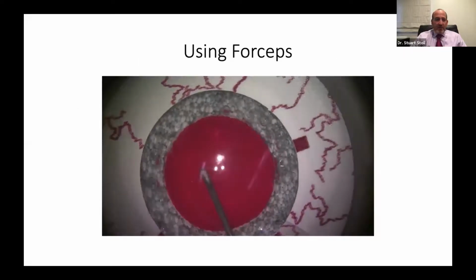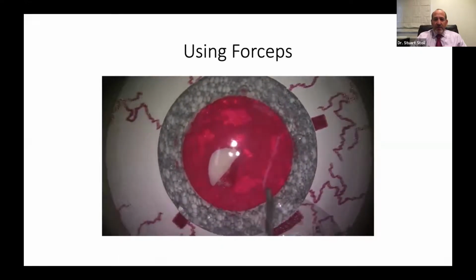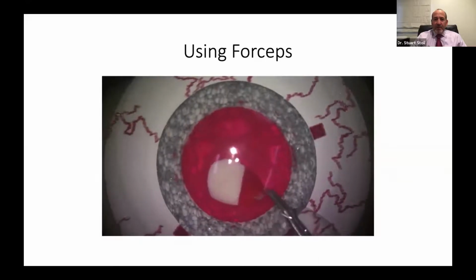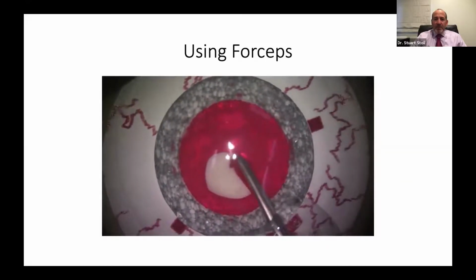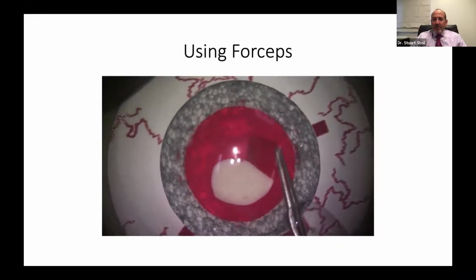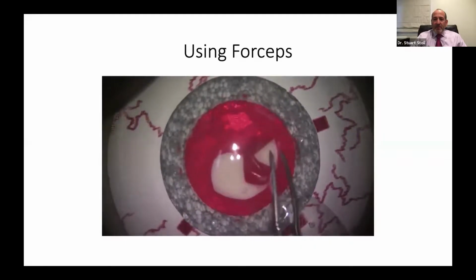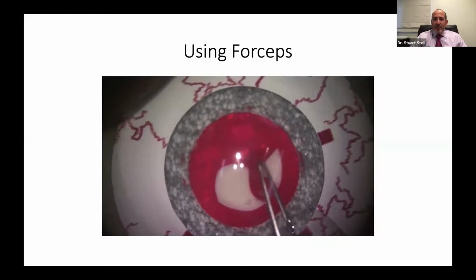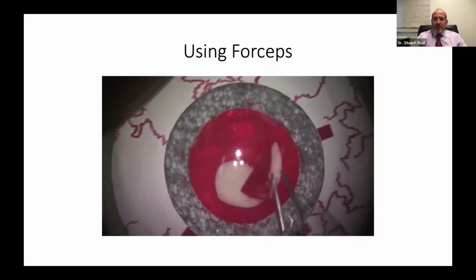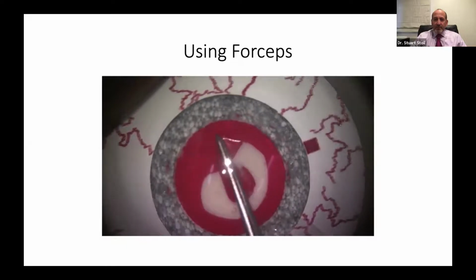So this is using forceps. We're going to start here, initiating with the forceps, and then we leave a nice flap there, grab it, pull down. Now we're on the 6 o'clock position. Leave the capsule in an optimal place, re-grasp it, tips are out to the side, following around, and that's using the forceps. There's fantastic control. We can reposition the capsule when we need to, and then continue on. There we go. Look at how we're leaving the capsule and then continuing on.